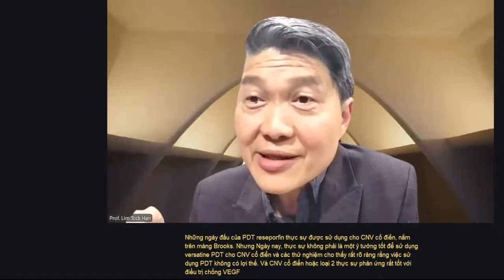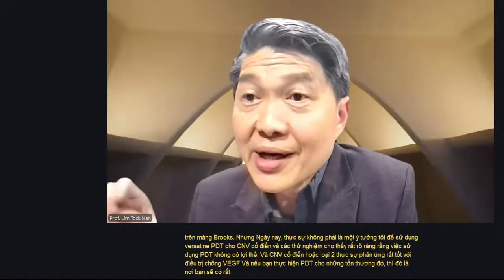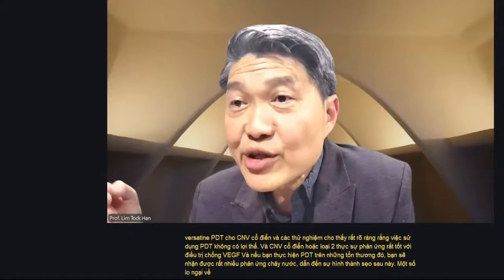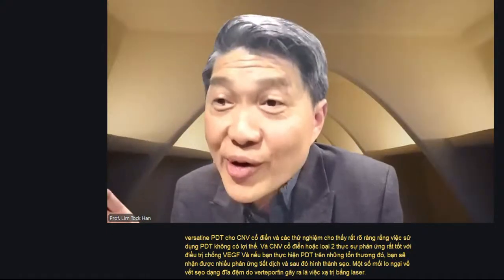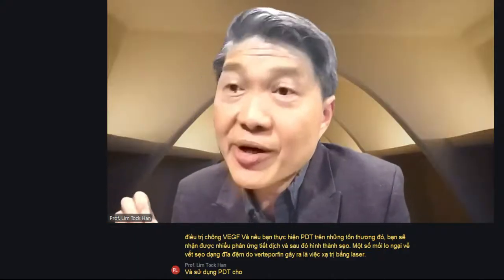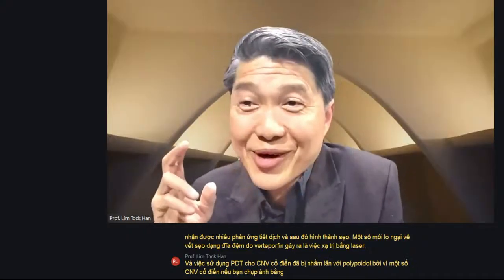If you PDT those lesions, that's where you get a lot of exudative response, and then later scar formation. Some of the concern about verteporfin-induced disciform scar is from irradiating classic CNV with PDT that was confused with polypoidal, because some classic CNV, if you image with ICG, actually looks like polypoidal.